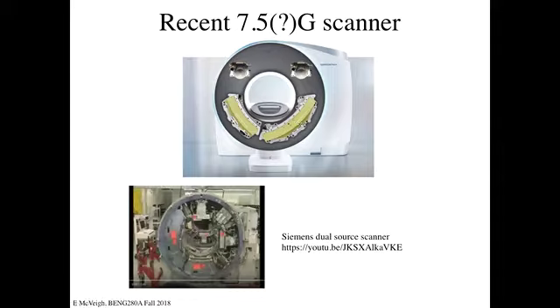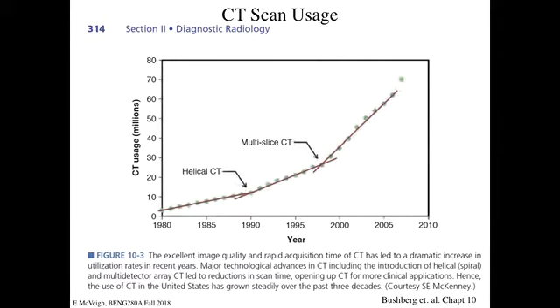So it's a bit shorter, probably due to the mechanics of having all this gear inside this gantry and rotating it. But at this YouTube site, they'll probably show you the whole thing rotating, etc. So that's a really cool way to make things faster: put two scanners in one.